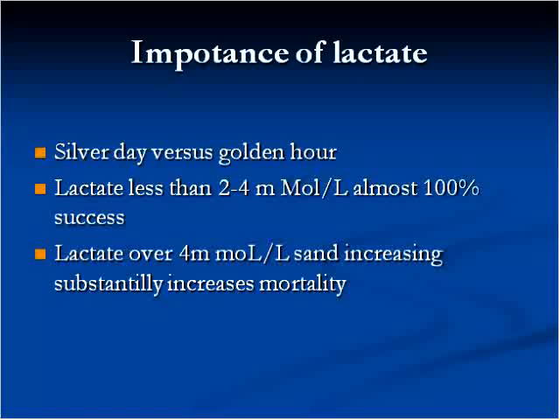And of course, in neonates, you certainly want to use the minimum. And that's been argued, that one machine is better than another because it requires less blood to run a bilirubin, for example. Again, I think that is a key issue. I know that with arterial line draws, you have a lot of blood wasted.